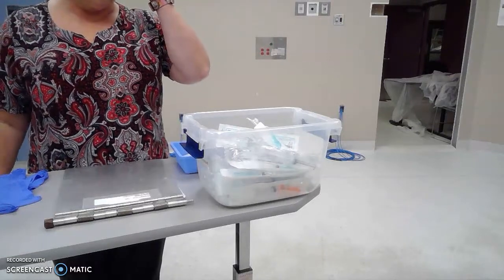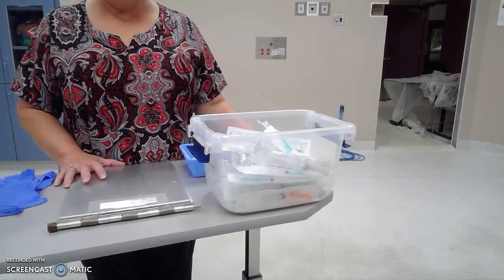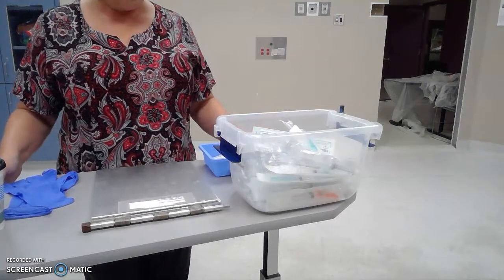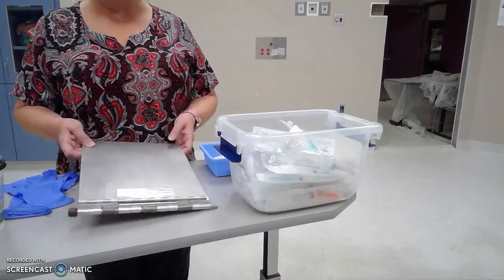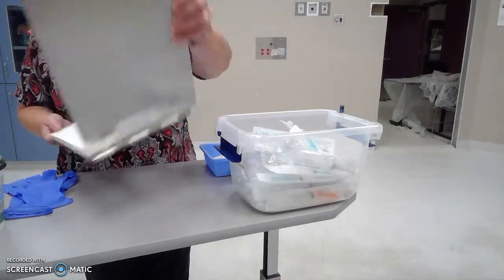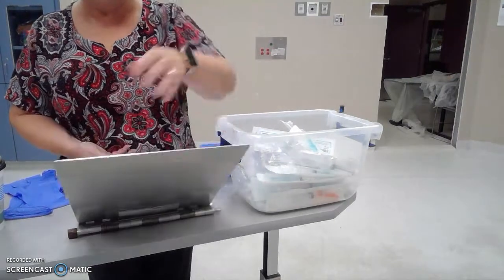Hello, this is the video showing you how to do the IV push for a medication on a patient where they have an INT. And this is how your setup for your checkoff is going to be. You're going to have your patient chart. You're going to come into your med room here. You're going to look in your patient chart and you have an order that says give Benadryl 25 milligrams IV push now.